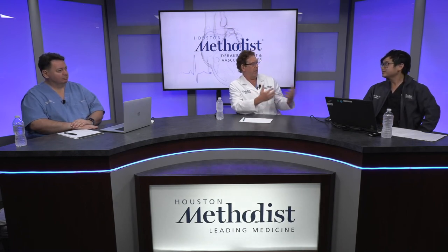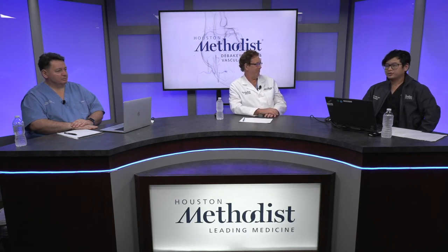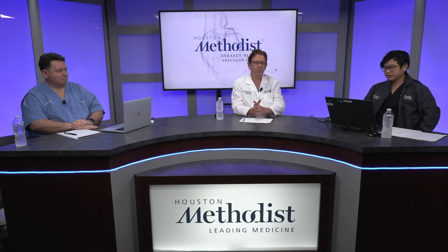And so I think we're going to kick it off by having Stephen here tell us a little bit, when I send a patient to get a carotid duplex, what do you actually do up in the lab? Well, first we receive the order to do the exam, and then from there, based on the criteria, if we need to move it up or prioritize it, we'll put it on the list and then send out a technologist to go see the patient.